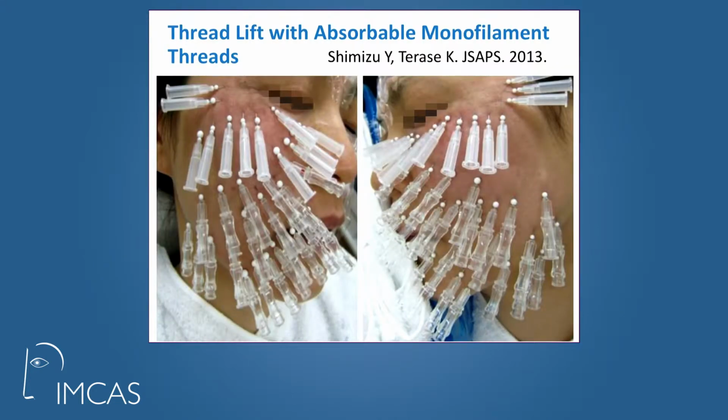Next slide. So this is a thread lift with absorbable monofilament thread. I took this picture from a Japanese article. They performed it with multiple absorbable monofilament threads placed on the subcutaneous plane.